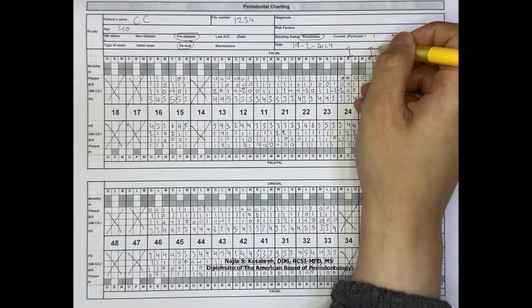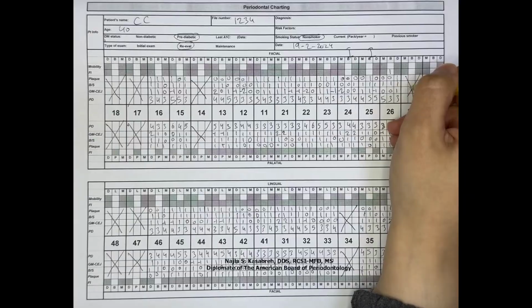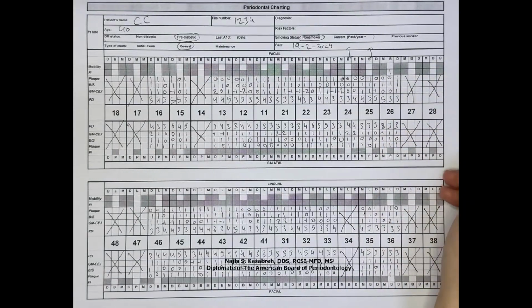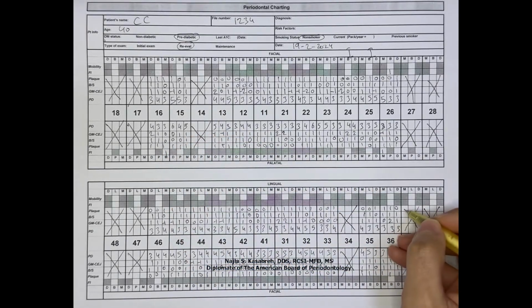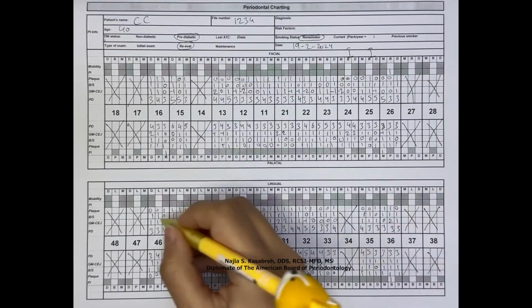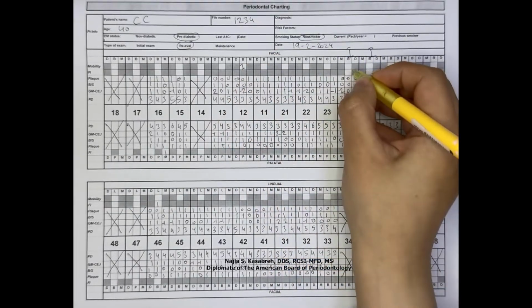When assessing furcation involvement, note that the buccal furcation of upper teeth is recorded from the buccal side, whereas the mesial and distal furcations are recorded from the palatal sides. Conversely, for lower molars, record the buccal furcation from the buccal side and the lingual furcation from the lingual side. Next, record the grade of the mobility of each tooth in its assigned box.